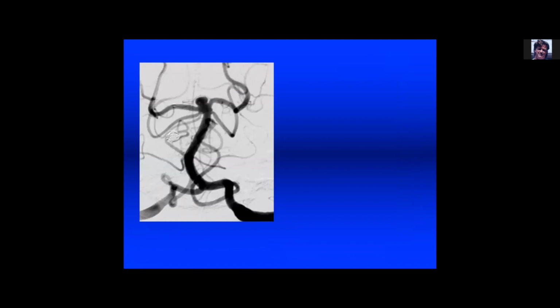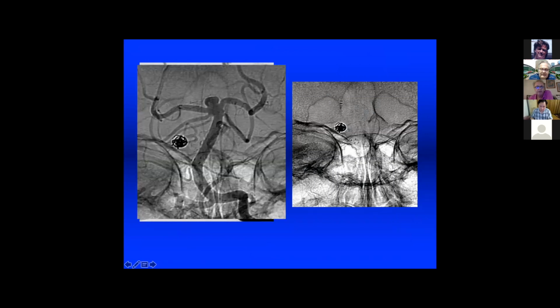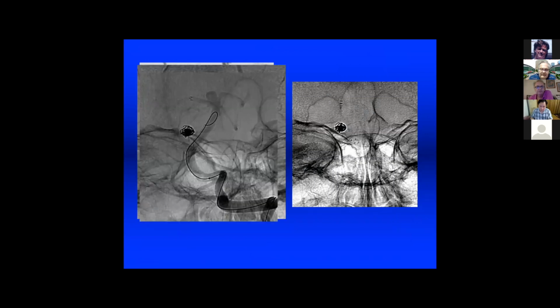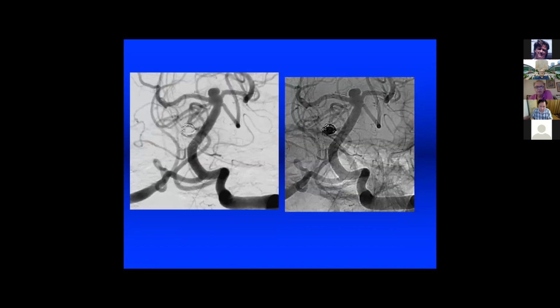In the basilar is another example to look at the kinking. Every time you have kinking, be careful with the kinking of the stent. Okay. This is the example when I cross one or second stent.